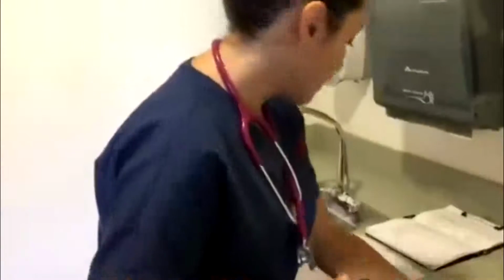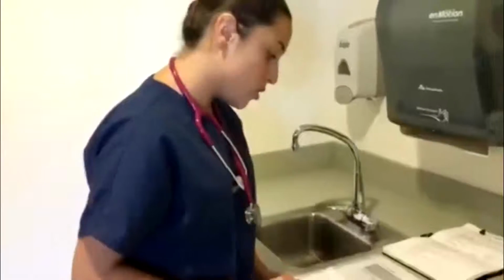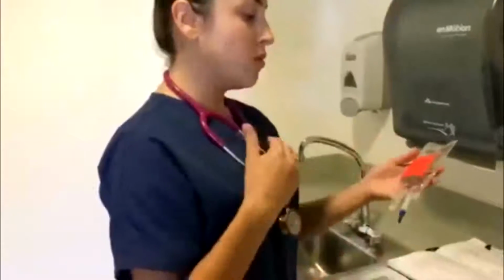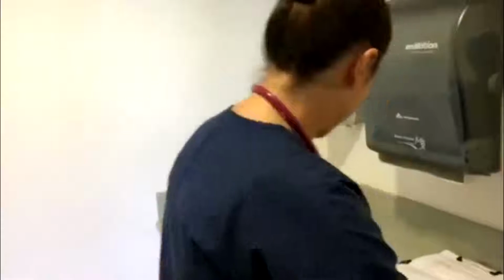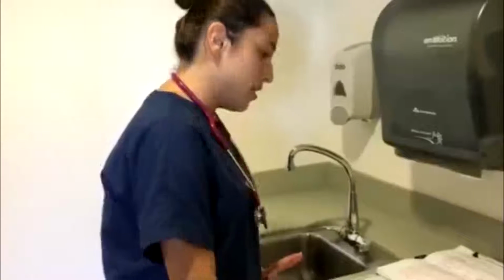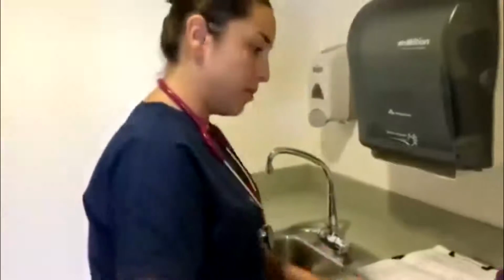But in this case, Mr. Sweetheart does have hypertension, as the doctor mentioned. So we want to infuse it more slowly over a span of 4 hours every 8 hours. So this is beneficial to his situation, so we don't increase his hypertension by causing him to retain fluid. So we don't want to exacerbate it. Okay. So now, after checking Skyscape, I want to make sure that the meds are compatible, which they are, and now I want to prepare both medications.